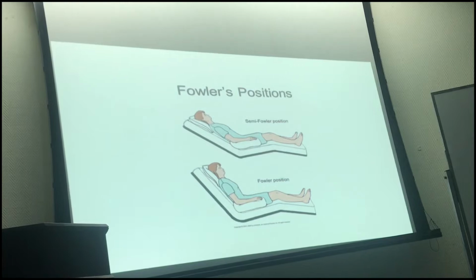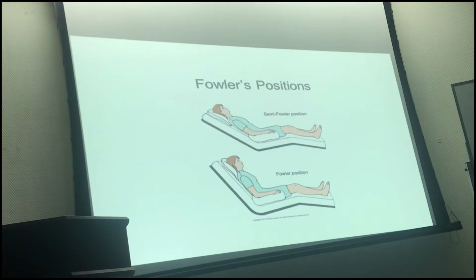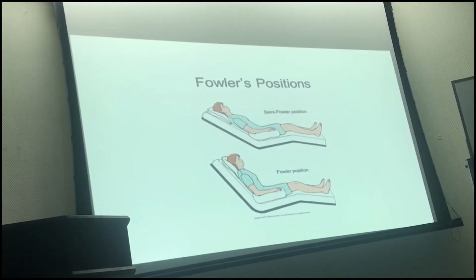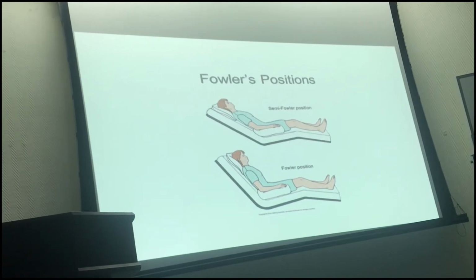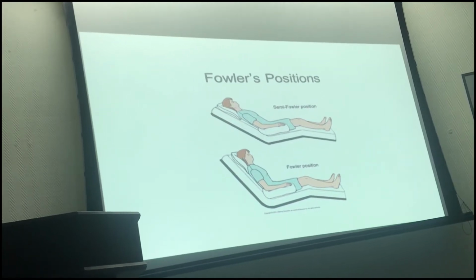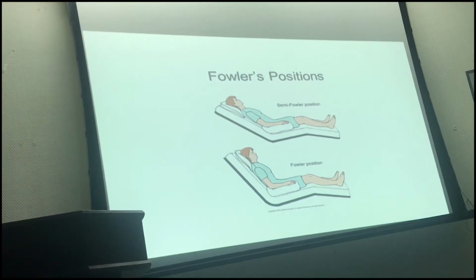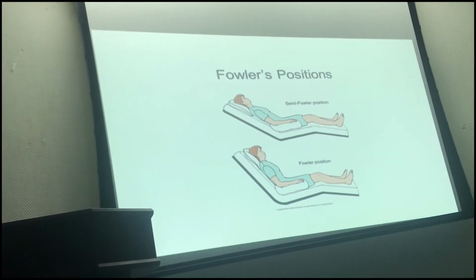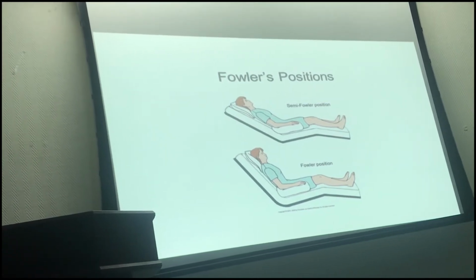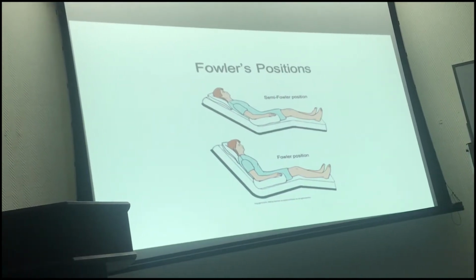So if the patient is on a chair, try to support his head with your hand, or put him against the wall. When he cannot move a lot, because when you introduce this, they tend to go back. So make sure that the head is supported and he cannot move. Sometimes, if the situation is bad, you can ask someone else to hold the patient's head and assist you.